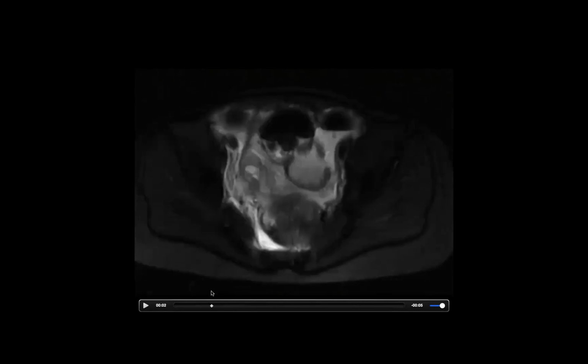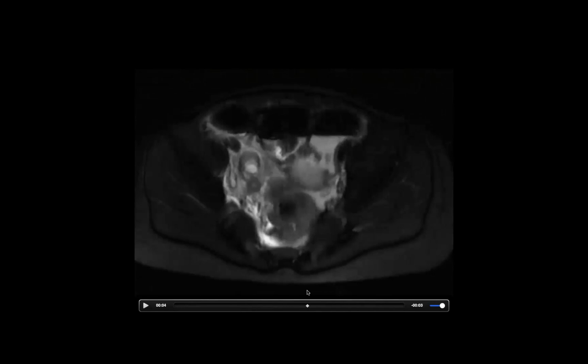This is a T2. This is a single shot T2. And one of the things that's interesting here is that we tried to fat sat this, but if you look at the back, you notice that the fat sat is not perfect, right? It's not totally dark. So this is all fatty tissue here. This is muscle, right? So this is buttock muscle here. And I wonder if folks have a thought as to why there is such a thick, dark line between these two?